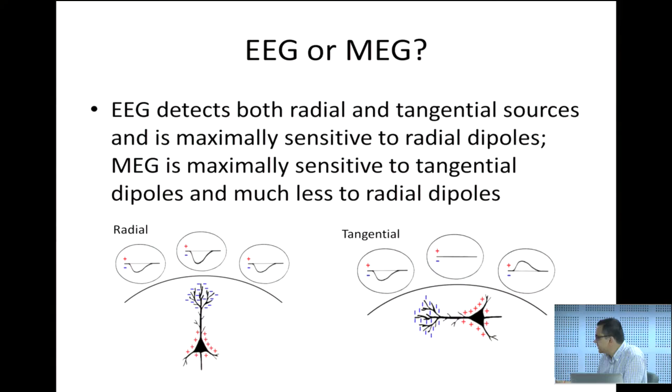So you need pyramidal cells in the same directions, geometrically and spatially aligned like that. All the dipoles are then approximated by what we call an equivalent current dipole. You just sum them up. What the EEG is picking up is the electrical activity generated by the equivalent current dipole, and MEG is the magnetic field created by the equivalent current dipole.